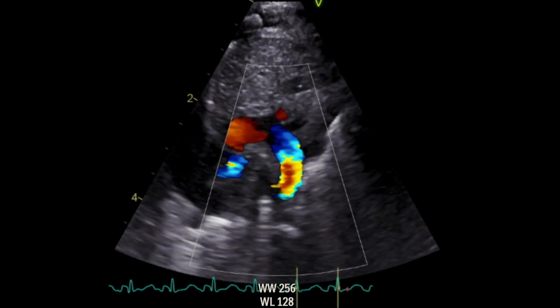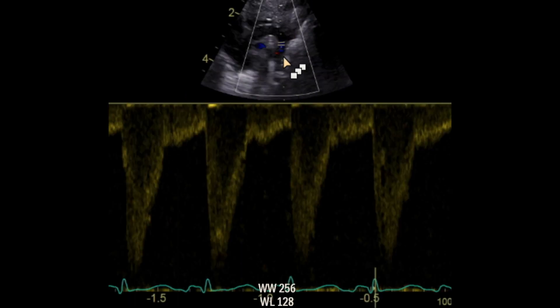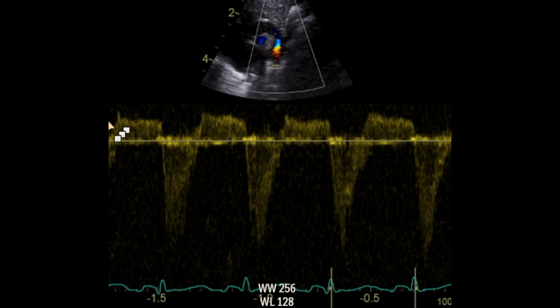If you tilt the probe towards the right side, then you're going to get the ductal view. When we Doppler the descending aorta prior to the ductal origin, it's very important to identify a normal diastolic flow. As you can see here, this is the systolic flow and this is the diastolic flow. As opposed to this flow — there is a reversal of the diastolic flow in the descending aorta post-ductally. Of course, this is one of the signs of hemodynamic significance of the PDA.